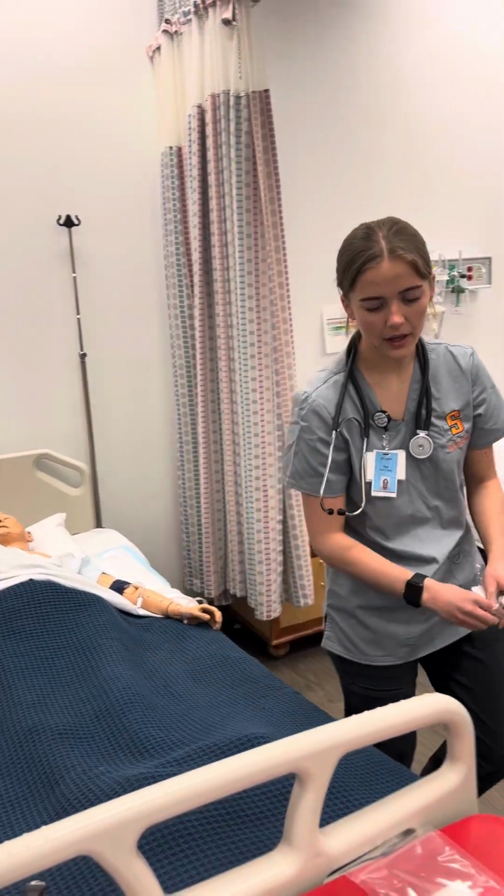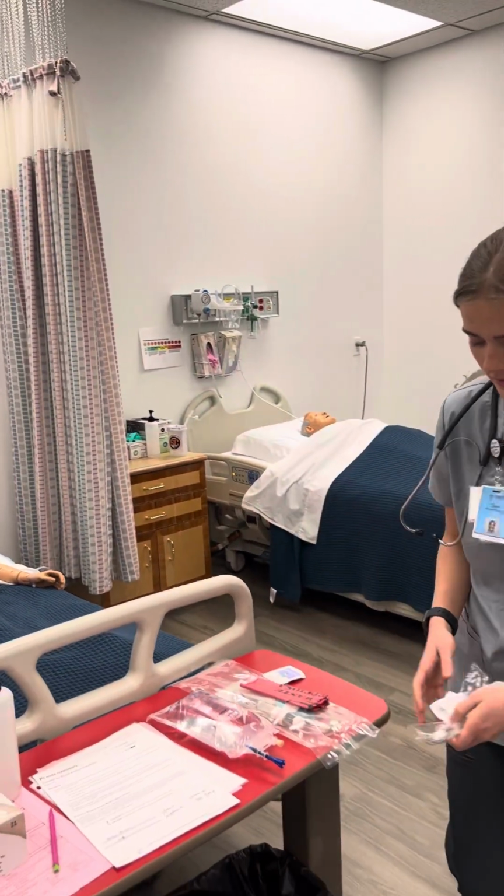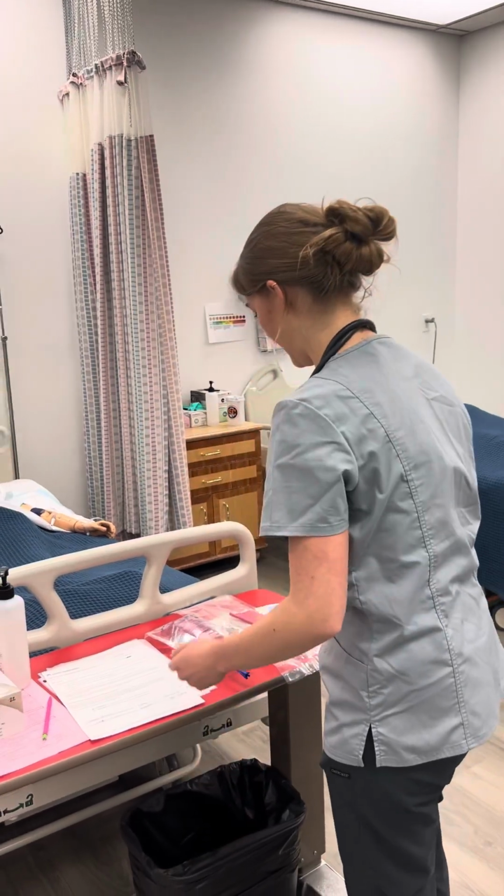Okay, now I'm gonna go ahead and get all my saline ready.